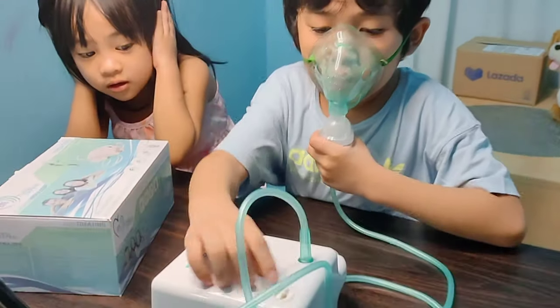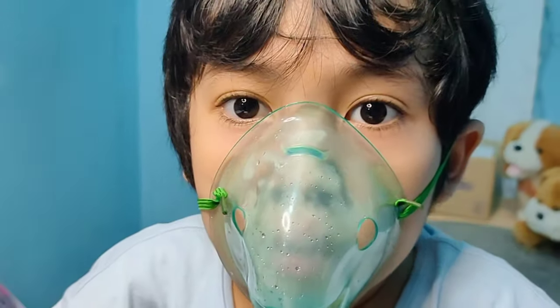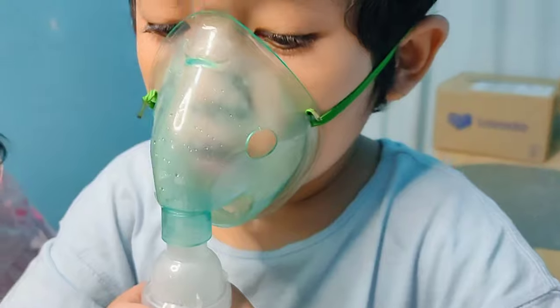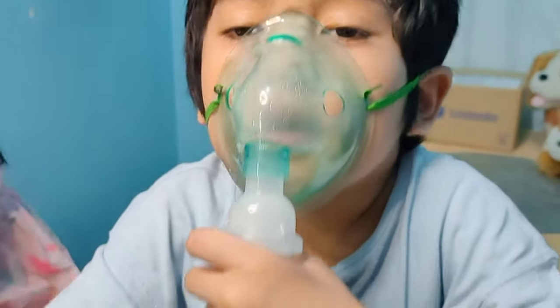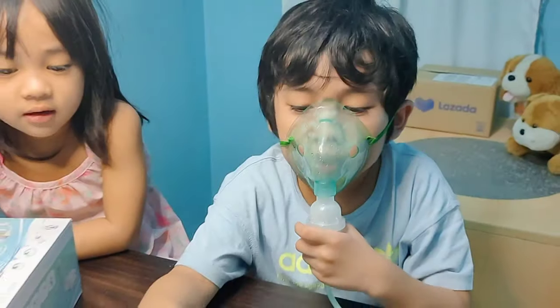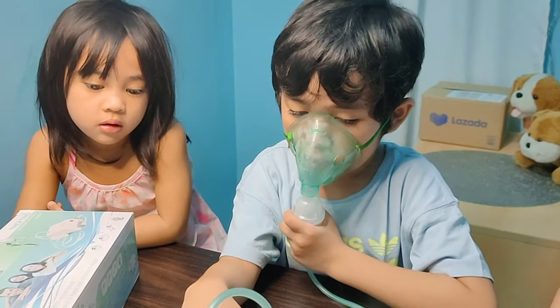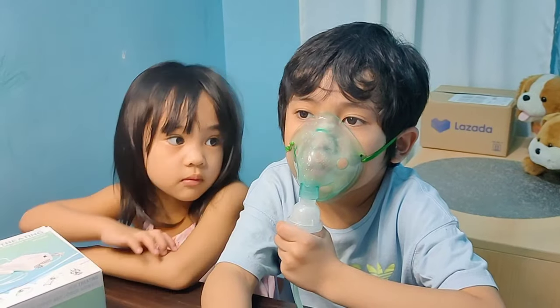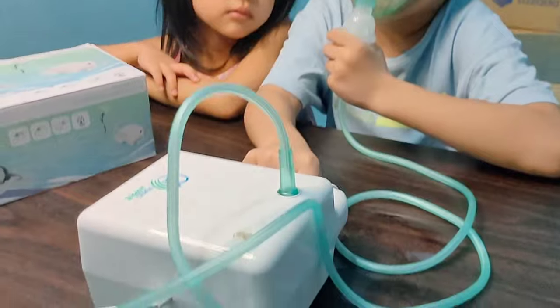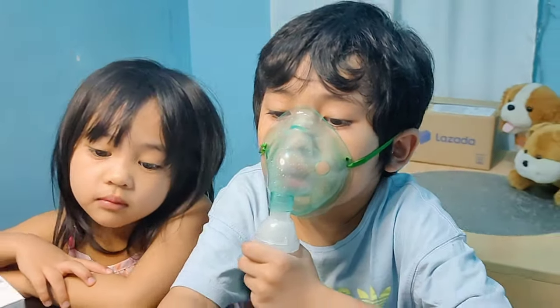Is it working well? There's the smoke — it's a diffused medicine. It's kind of noisy though, but that's fine.